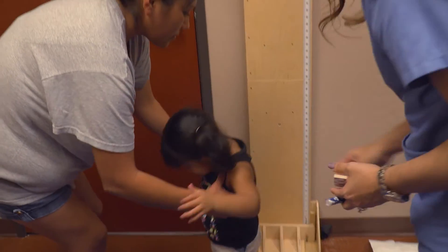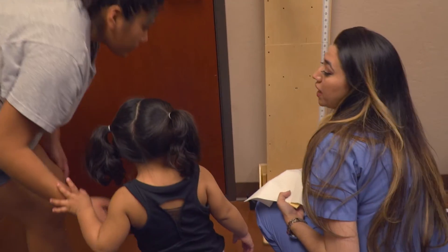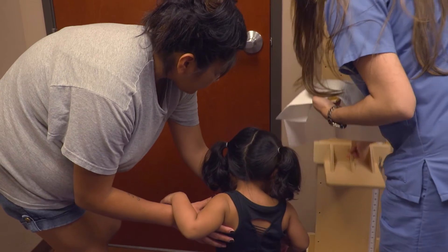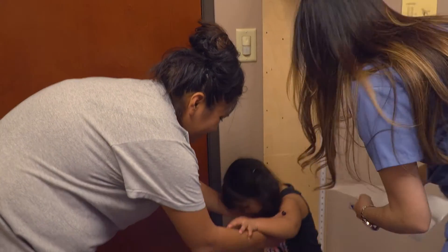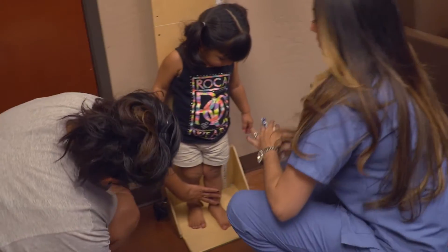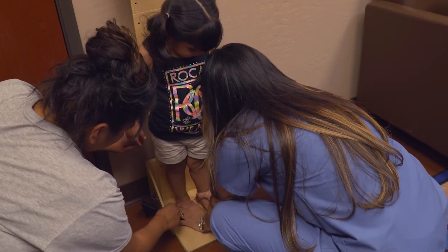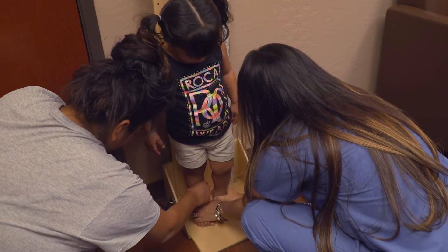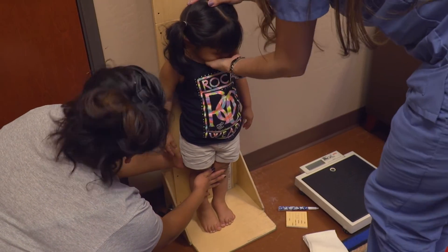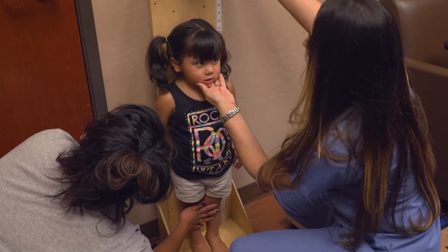So next we're going to get her height, Mom, but we're actually going to make sure she's standing straight. So if you can actually help me by making sure her knees are straight. I'm going to place this down really quick. We'll have her place her feet together. Can you scoot your feet back, honey? Thank you. Right there. Just make sure her knees are straight, Mom. And then I'm going to have you lift your head up. Look straight.